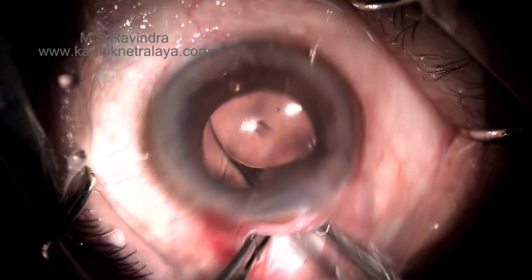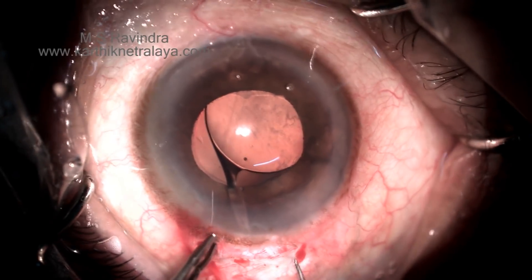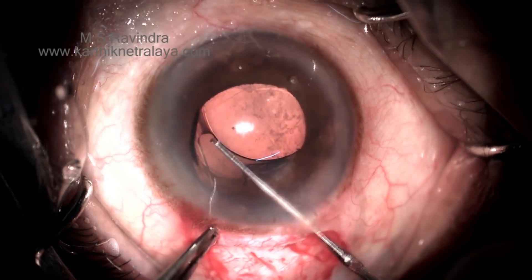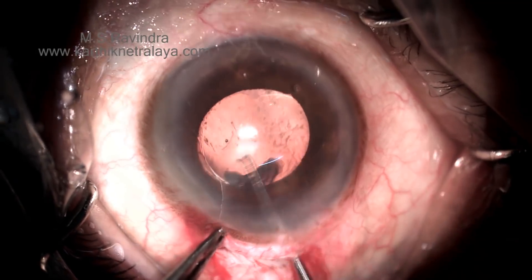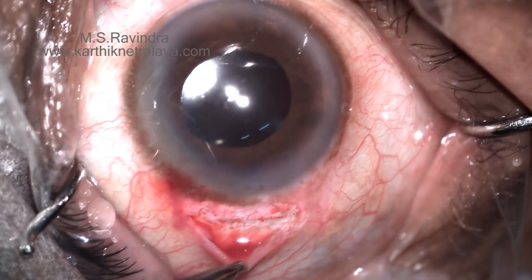The IOL is injected without folding into the capsular bag. Non-folding of the IOL is of great benefit because it does not create the vertical striations that you normally see when injecting it.